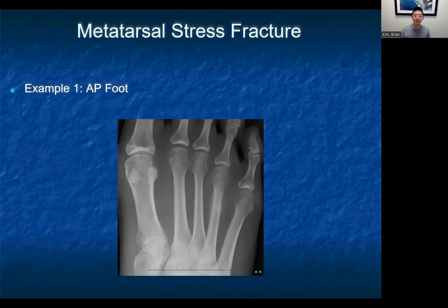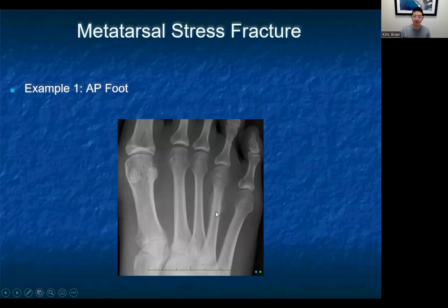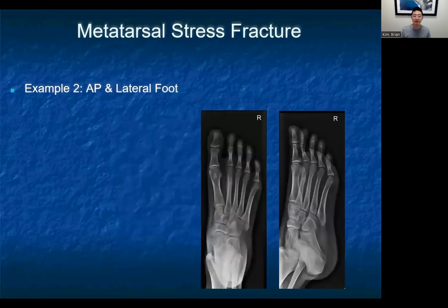On this AP image of the foot, we see a classic fluffy, almost cotton candy-like density surrounding the metatarsal shaft. This indicates a periosteal reaction, which is a classic sign of a stress fracture. If you're able to zoom in, there is a subtle linear lucency at the metatarsal shaft as well, consistent with a fracture line, though this may not always be seen — the periosteal reaction itself may be enough to diagnose a stress fracture. In another patient, you can see a similar periosteal reaction and lucencies consistent with a stress fracture of the second metatarsal shaft.